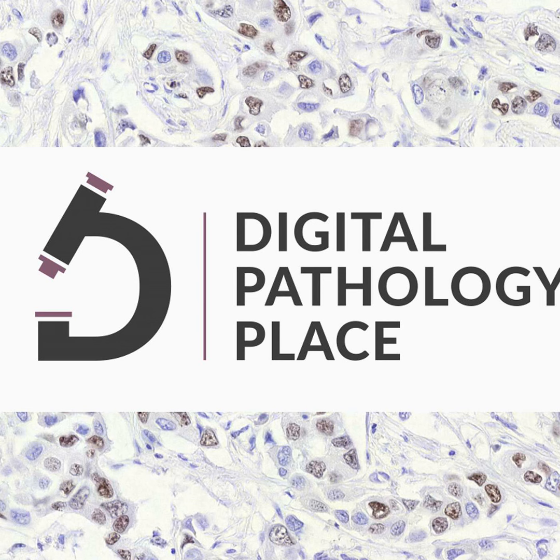And they were of the opinion that their homegrown compression scheme was better than using JPEG or JPEG 2000 in DICOM, because DICOM uses standard compression schemes in order to minimize the burden on the implementers. In retrospect, that probably proves not to be the case, but at some point in time inside Philips, one must assume that they thought that there was an advantage to doing it this way in terms of image quality or speed of retrieval and review, or whatever parameters they were trying to optimize for.